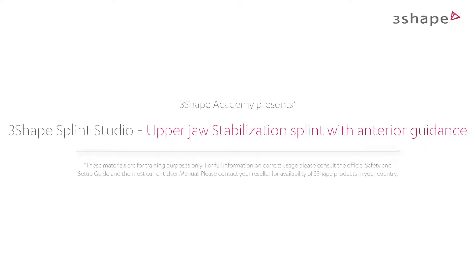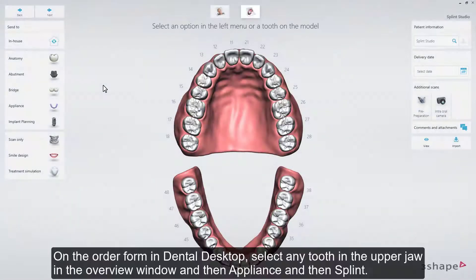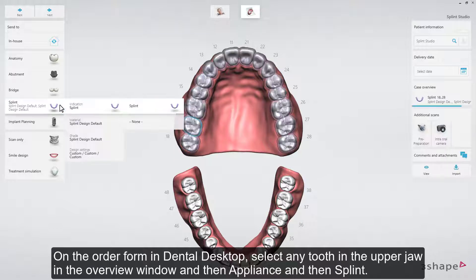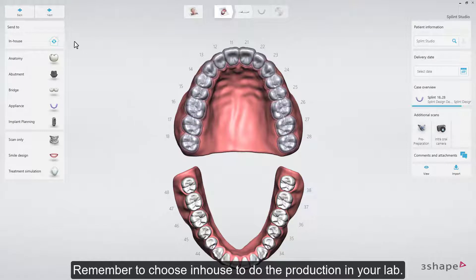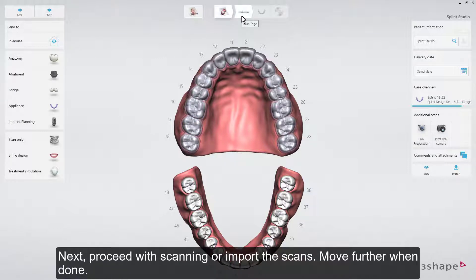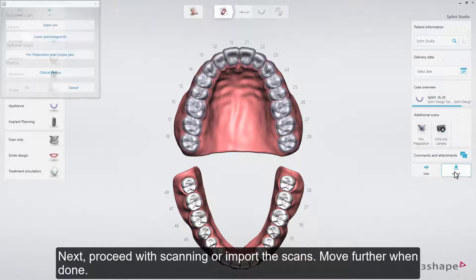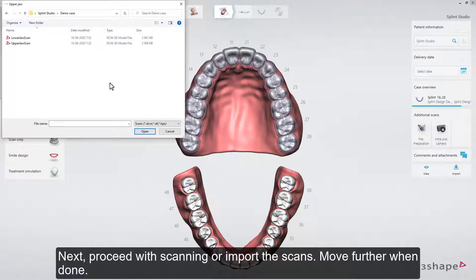Splint Studio can help you design and create a stabilization splint with anterior guidance for the upper jaw. In this video, we'll show you the workflow to achieve such a splint. On the order form in Dental Desktop, select any tooth in the upper jaw in the Overview window, then Appliance, then Splint. Remember to choose In-House to do the production in your lab. Next, proceed with scanning or import the scans, and move further when done.